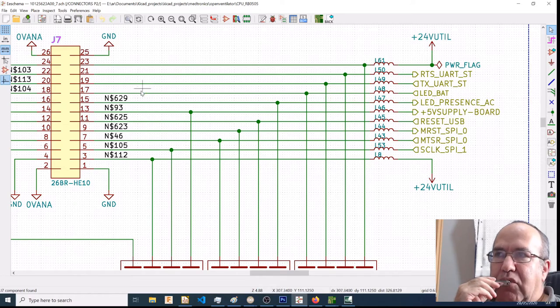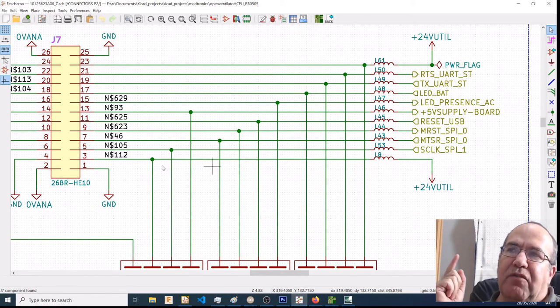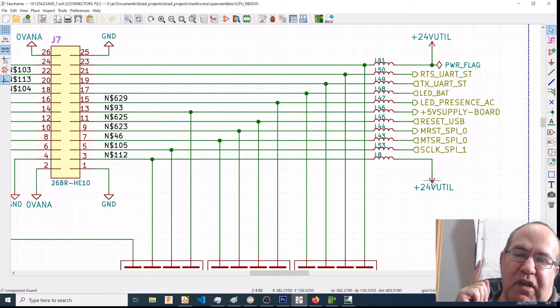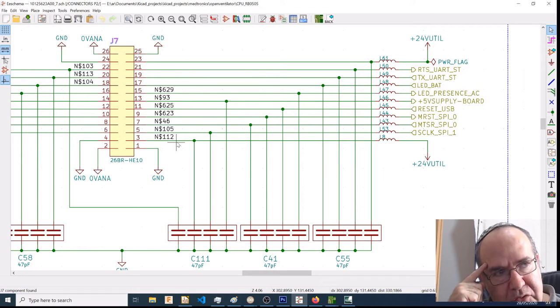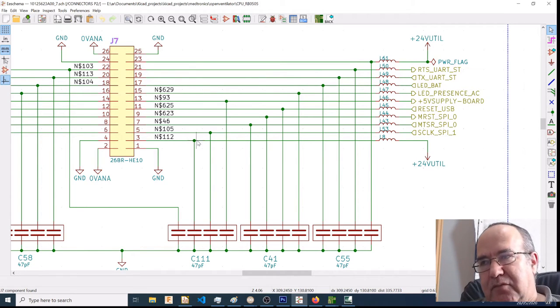Your power into the board would be pin 3 and pin 23. So one could take either off pin 3 or pin 23 before this coil or after this coil, 24 volt out. This would be when I said utils, and even before utils. Even before util, one could take 24 volt to power the O2 valve.